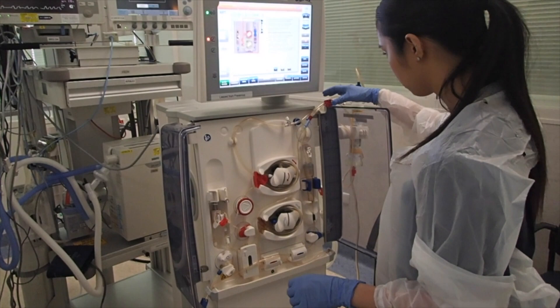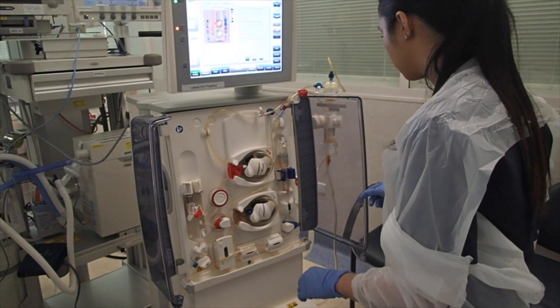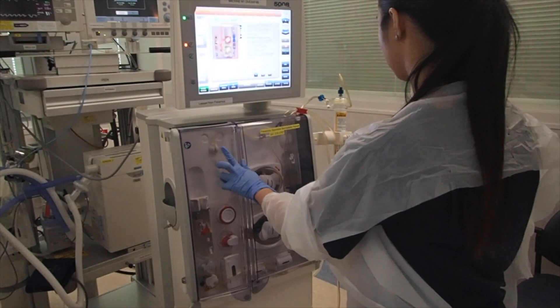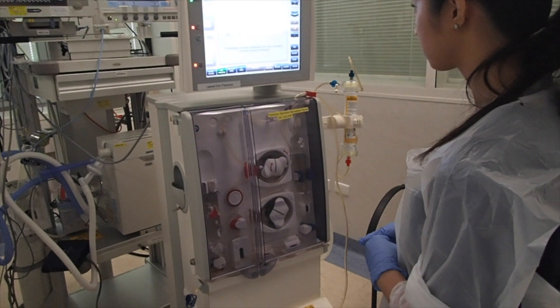Before closing the doors, make sure you unclamp everything. Leave the side arms and heparin clamped. Now you can close the doors and the machine will start to wind the pump segments. It will then do a check.